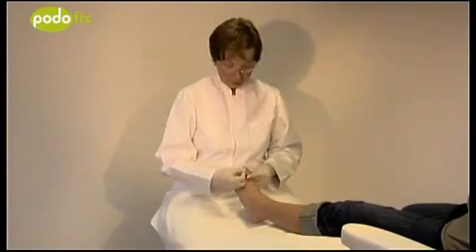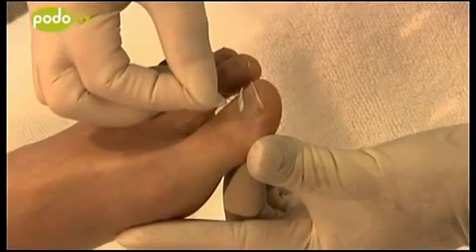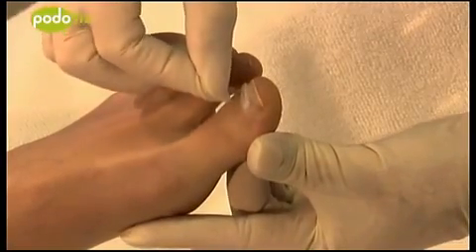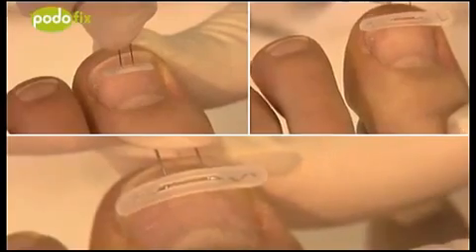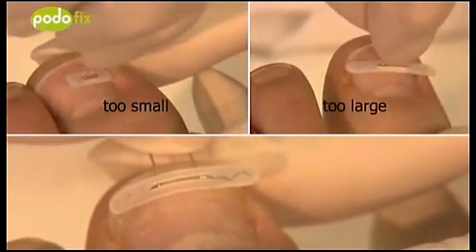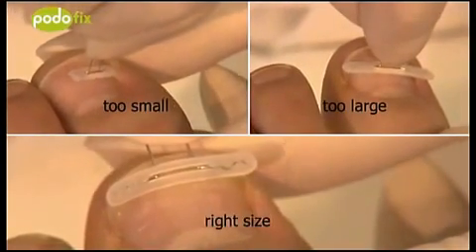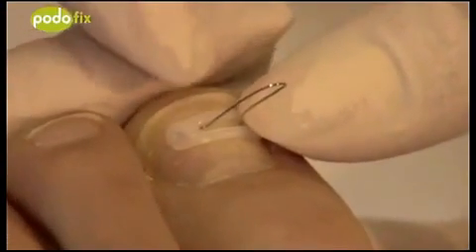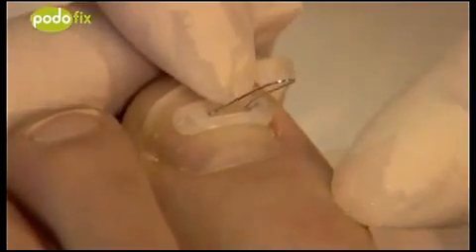The size should be chosen so that the brace can be adhered at least to the ingrown side of the nail, as close as possible to the edge, but that does not press on the nail crease. A smaller size brace can in general be used, which is then placed as close as possible to the affected nail side.